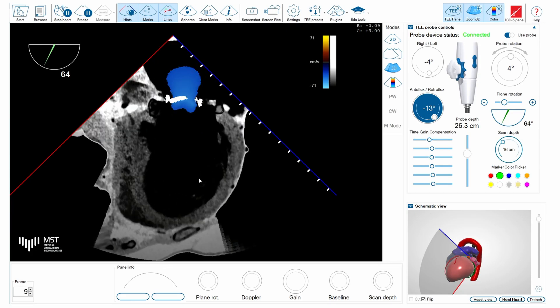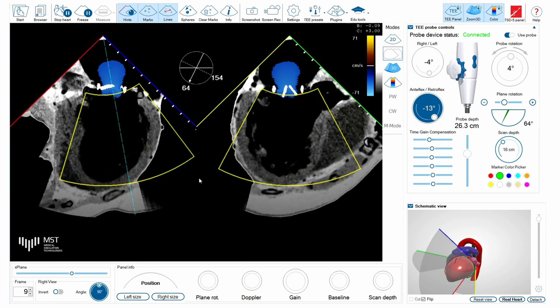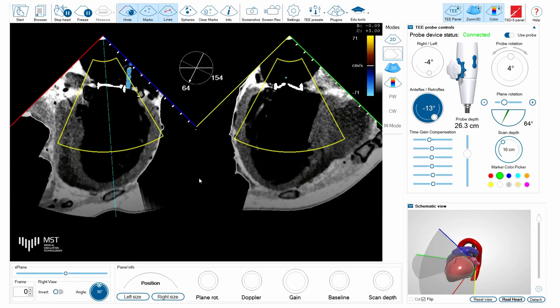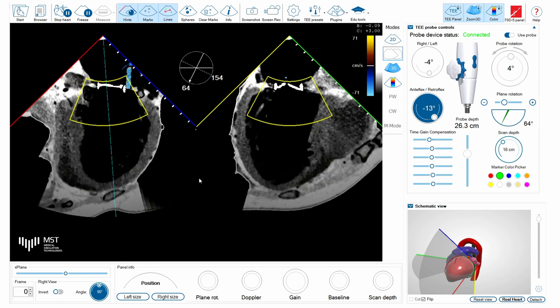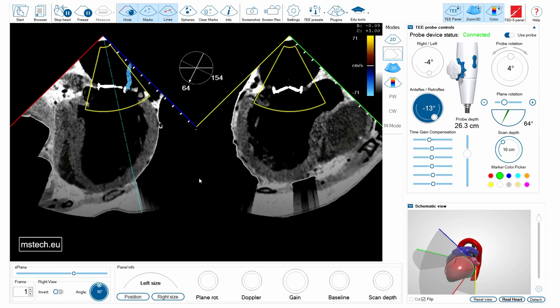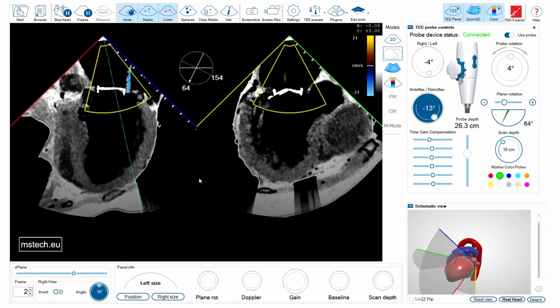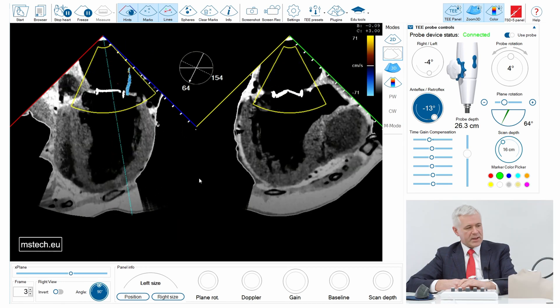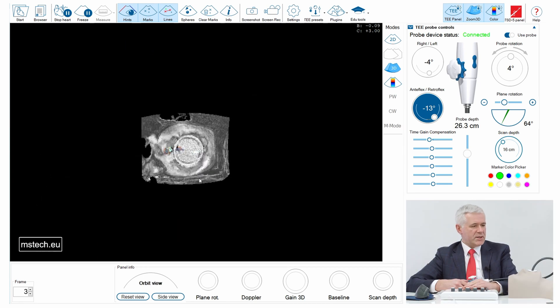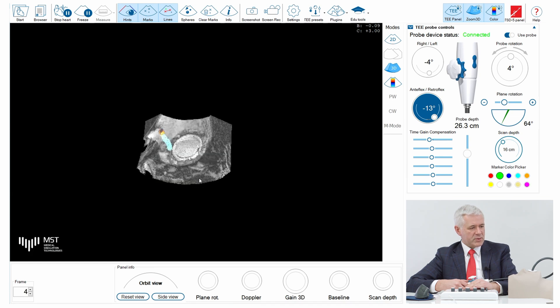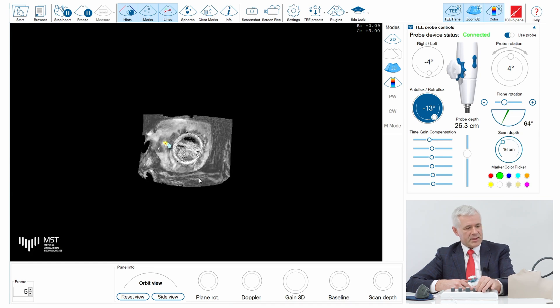So let's have a look at how it looks in 3D imaging. I put my region of interest at the level of the mitral valve, activate the 3D imaging, and here is the color 3D mode showing you where the paravalvular leak is located.